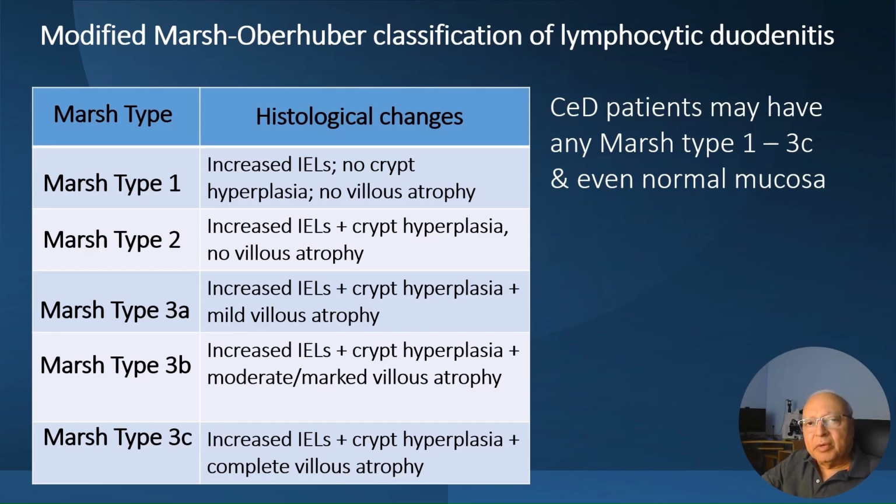So typically pathologists associate the higher Marsh grades with a greater likelihood that it is celiac disease. And that is true, but that applies to untreated celiac disease in a properly taken duodenal biopsy in a patient who is exposed to gluten in an ongoing fashion. So there are too many variables in that.